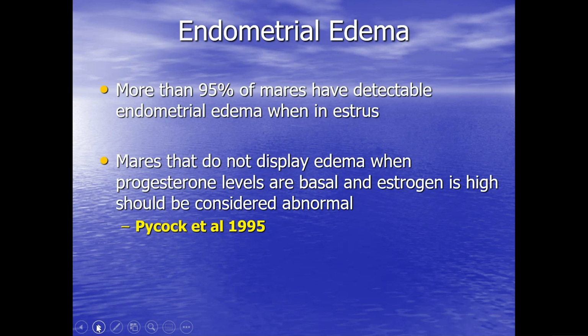So it could be there's a remnant of luteal tissue there. So I would urge you to do the little injection of a very tiny dose of prostaglandin. But if you still don't get any edema, I would keep monitoring her. She may go on to ovulate, still no edema. If that is the case, I make in big bold notes in her record, this mare may ovulate with no edema developing. Then at least the subsequent cycle, we think, well, hey, this is this mare, so we better go ahead and inseminate her.